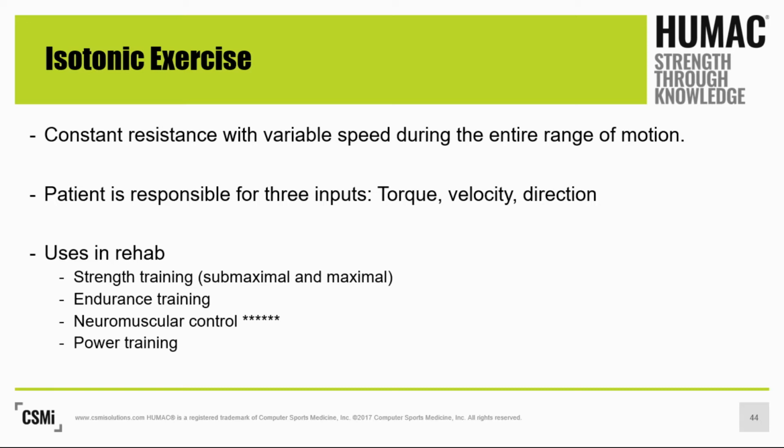On the machine, we're going to show you how you can use the software to do both of these, but also in a way that significantly enhances neuromuscular control and proprioception. I'm also going to show you how you can use the machine for power training and rate of force production in the later phases of rehab.